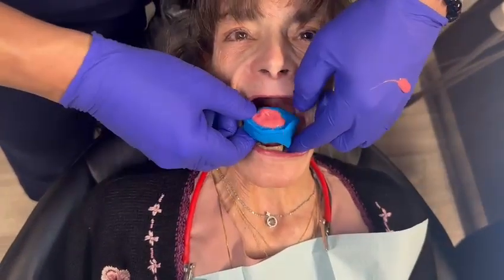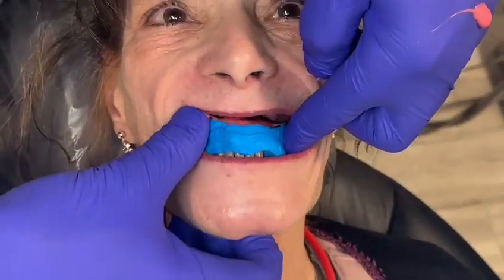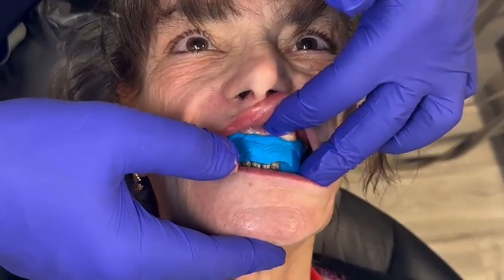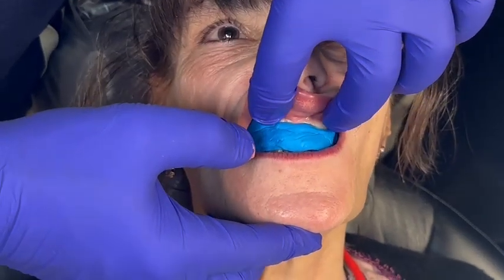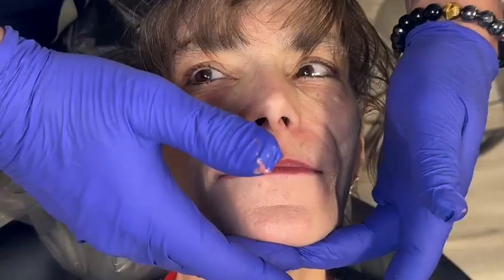So now all I have to do is open, put it on the teeth. Let me see a bite down again. The putty's holding the vertical while we capture the impression. Now that's a three-minute set time on this — that's the only slow part about it. Can you close your lips comfortably?